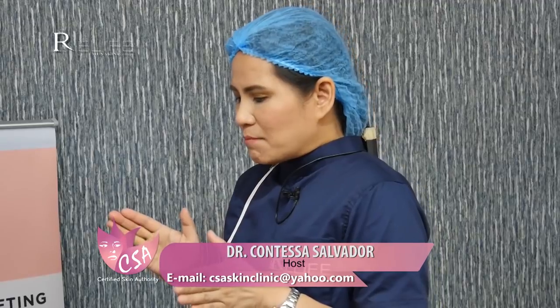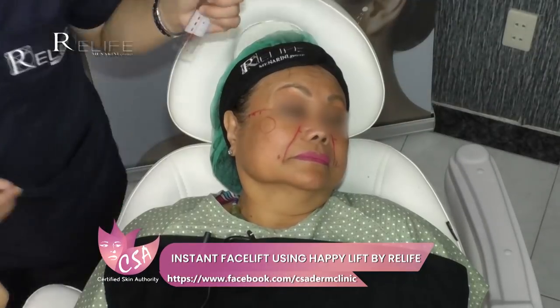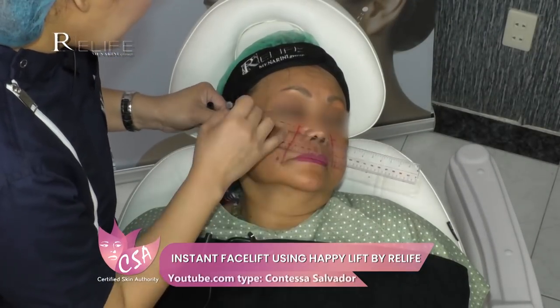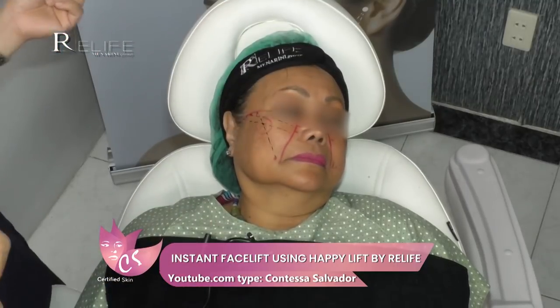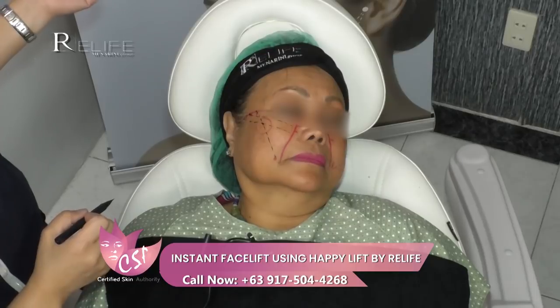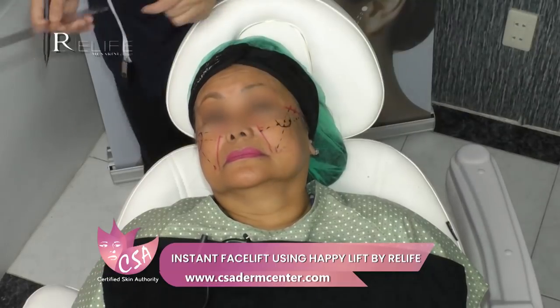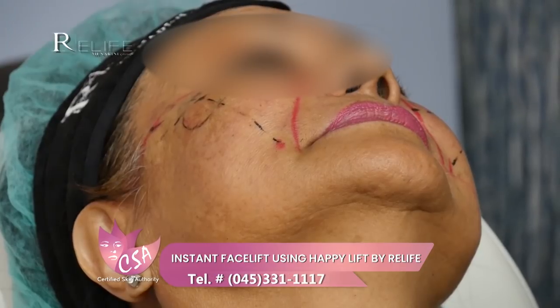We have with us Ma'am Reza, and we did already the surface landmarkings. There are important landmarks to take note of. We have two safety lines. The first safety line runs from the lateral canthus to the tragus of the ear. The second safety line is from the medial canthus to the modiolus.